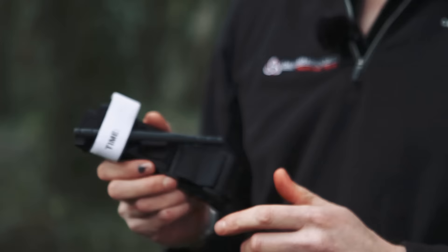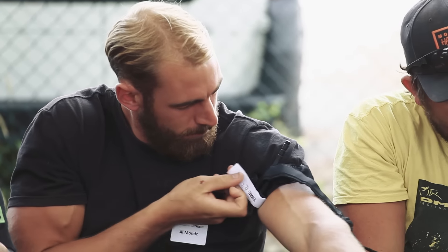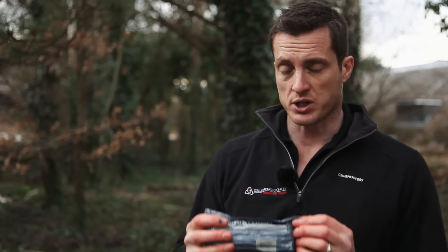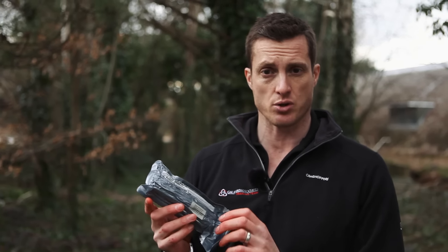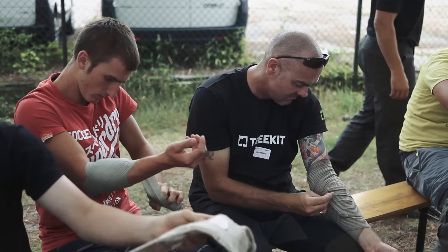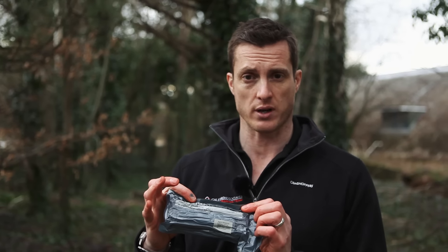This course has been designed around two key pieces of equipment. The combat application tourniquet is a great bit of kit, standard issue to all British and Allied troops, and is designed to very quickly stop a catastrophic bleed from arms or legs. The second piece of equipment is the emergency care bandage, or haemorrhage control bandage. Again, it's standard issue to the British military and is designed to apply pressure to a wound and bring quite heavy bleeding under control very quickly.